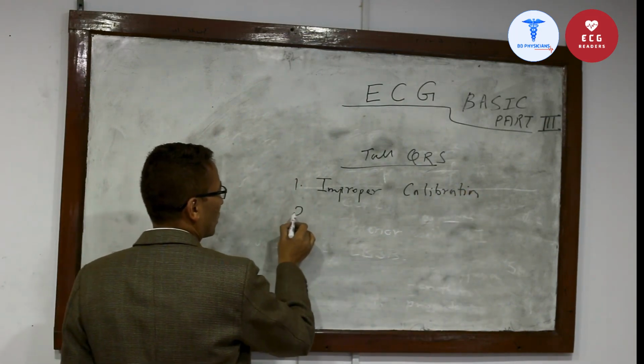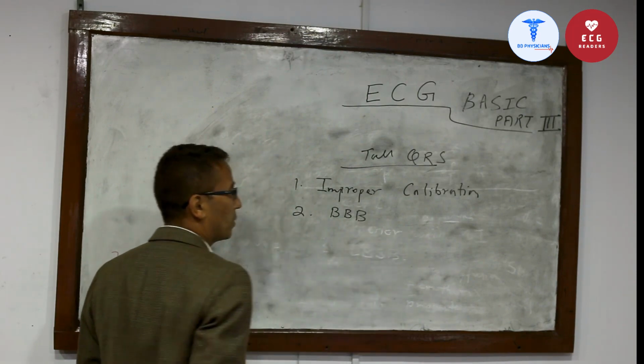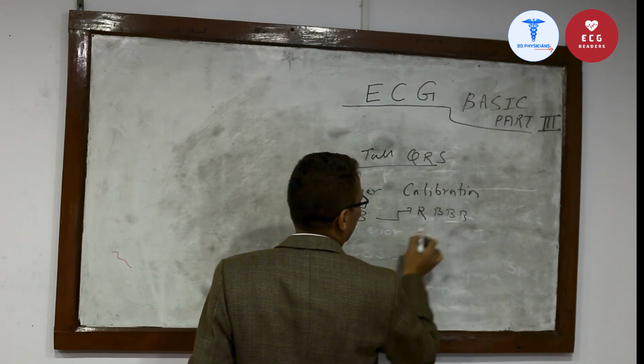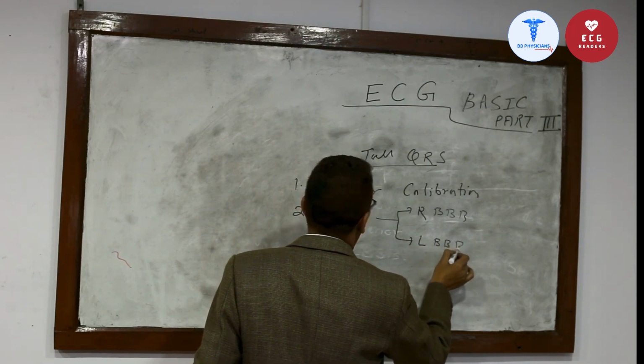It may be due to bundle branch block, which can be right bundle branch block or left bundle branch block.